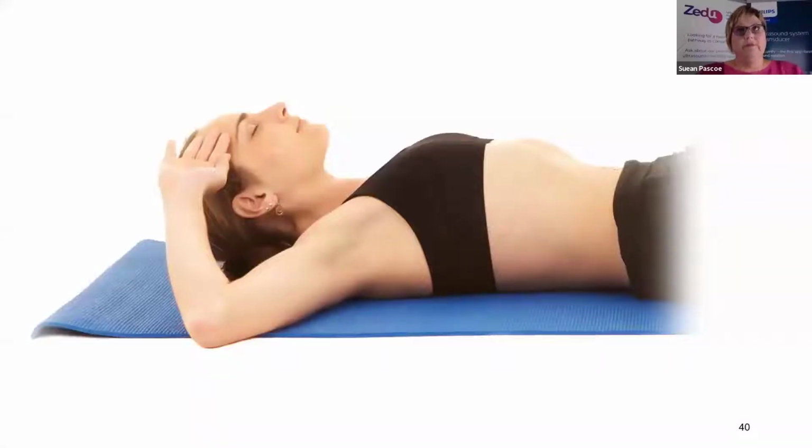My top tip here is to put your middle finger on the xiphisternum and run that around so that you get the height right, and where your fingers touch, come into about the mid-axillary line here, and then put your probe on. That's going to be at about the level of the Morrison's pouch.